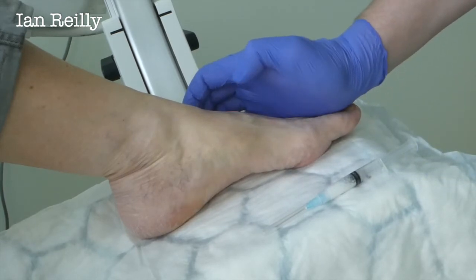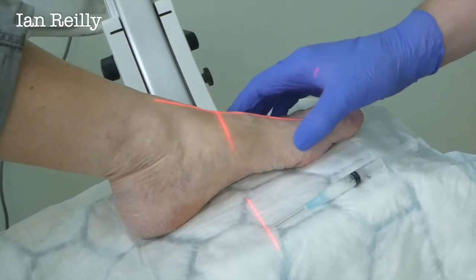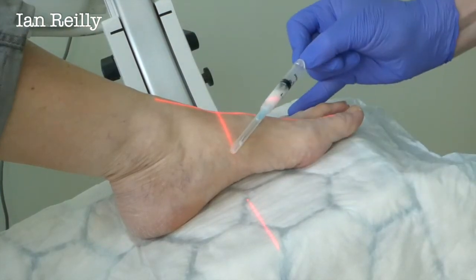I'm just going to put our laser guidance on — can you just see that? Check the camera — yeah, that looks pretty good. So I think that's about the sore spot there, and I'm just going to use the tip of the needle to do a little check x-ray.